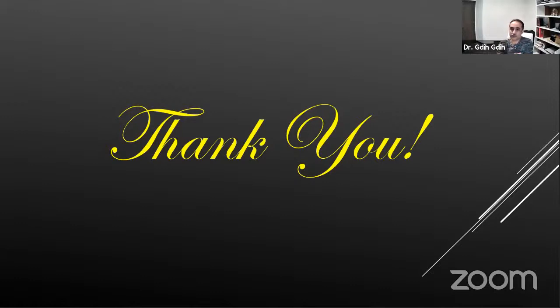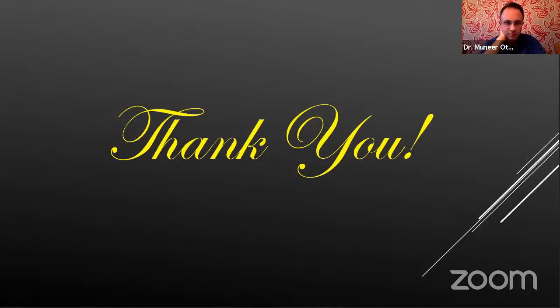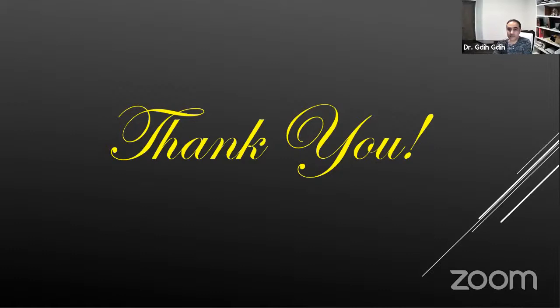If someone shows you a visual field and says, what do you think? And then, okay, I think this and this and that. I think you definitely succeeded in this. Thank you very much. Okay, if you don't mind, Dr. Maz, I'm just going to go through some of the questions here on the panel.